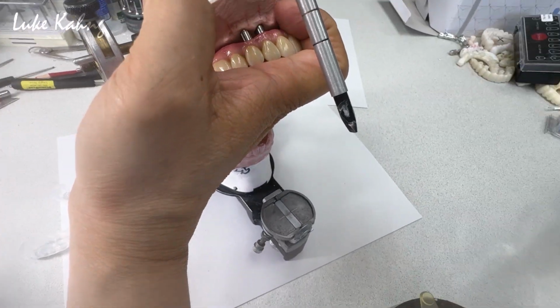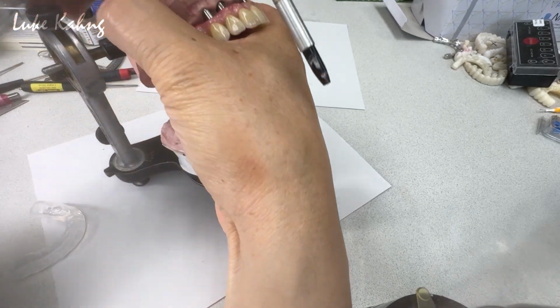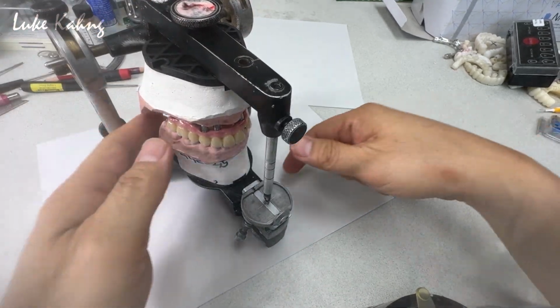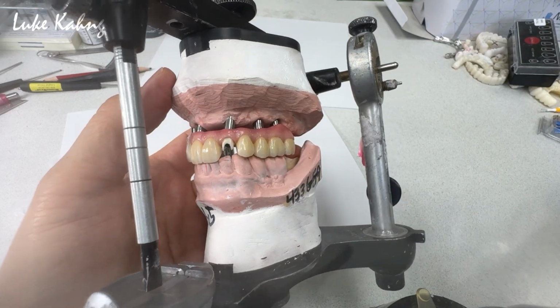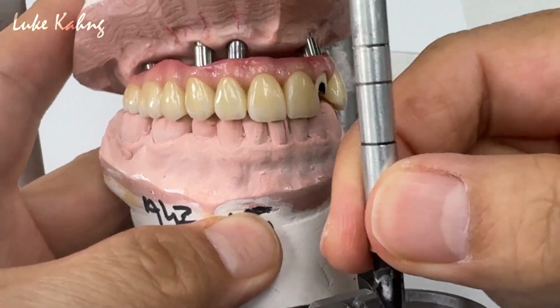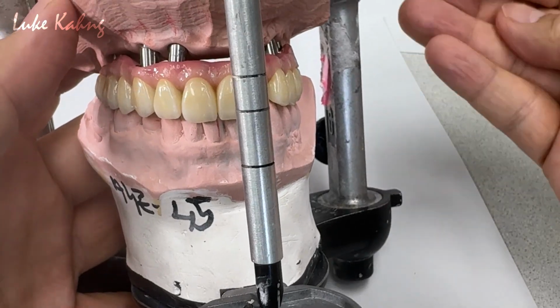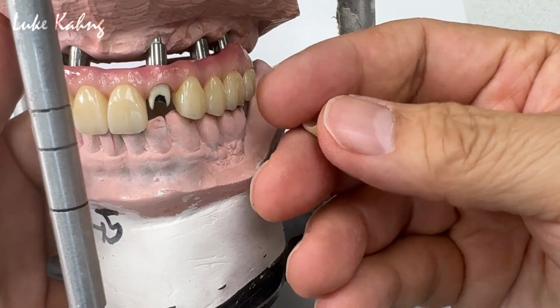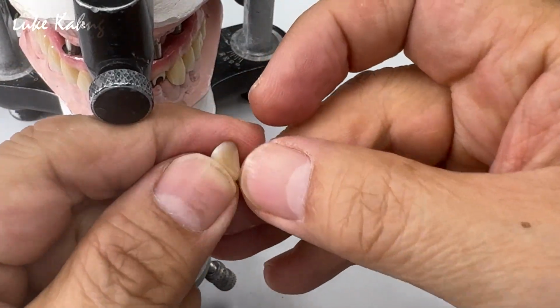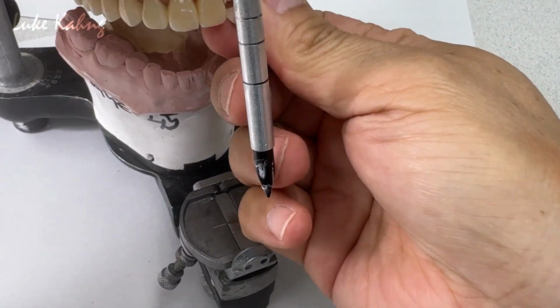So after we mount it, this, so we can get the best occlusion contact like this. Okay, so doctor provided these great articulations, and this is another single, so she is going to put it later. Sometimes I make the notch in the back side, sometimes I don't, depends on the doctor. Anyway, this is the final.